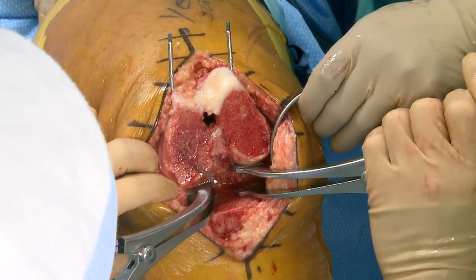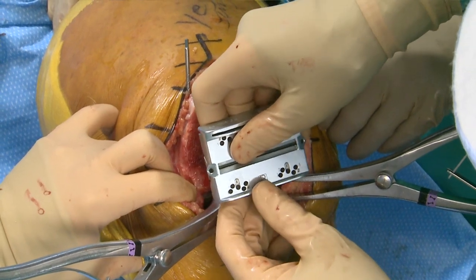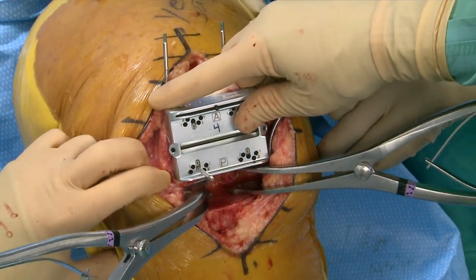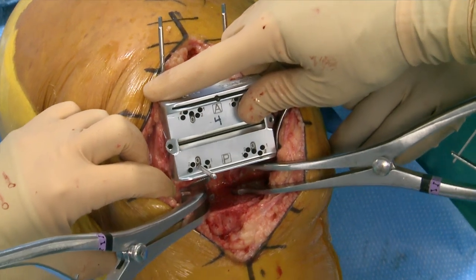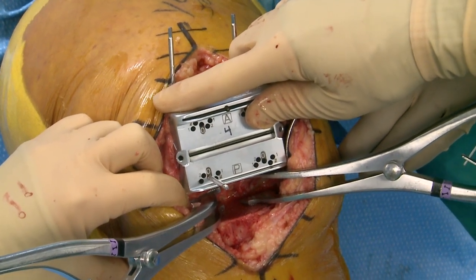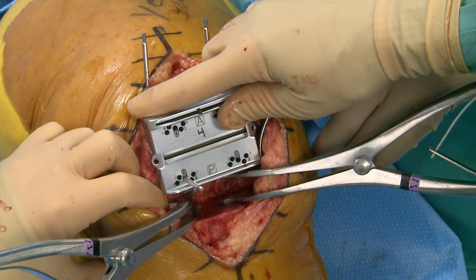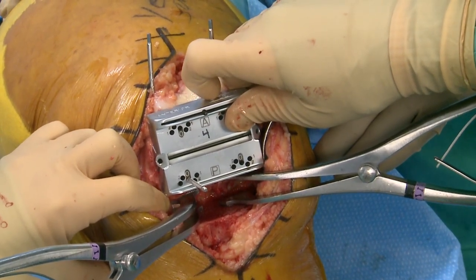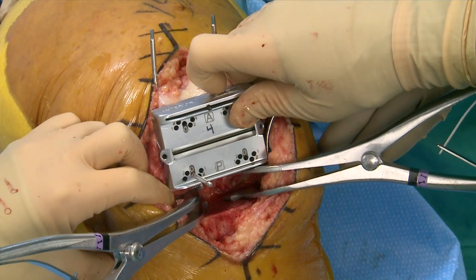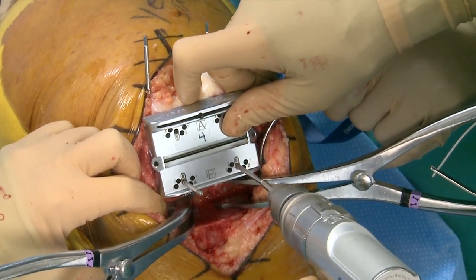With laminar spreaders I have no idea how many Newtons I'm putting on — I just tension it until it's fully tensioned. I'm eyeballing 90 degrees. With full navigation capability I would have trackers on, tension it, take a snapshot at 90 degrees, and move the femoral component around until I like the gap size — that's the next evolution going from Plus to Pro. I like that the block is parallel to my tibia, so I'll pin the lateral side.